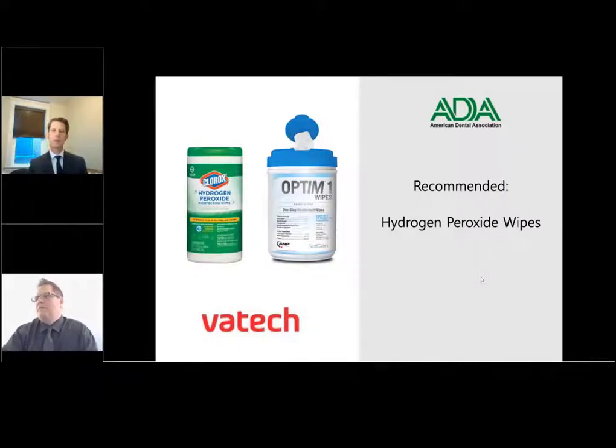Just use the wipes, wipe it down, let it sit, and that is what we are recommending for cleaning our devices. Yeah, so no alcohol is recommended. Right, no alcohol, no Cavi wipes. Those are things we do not want to use there.